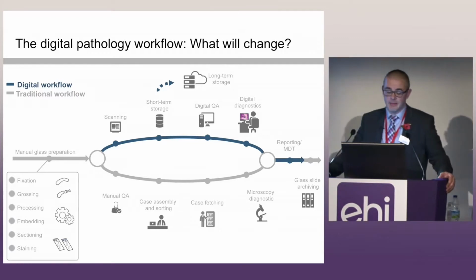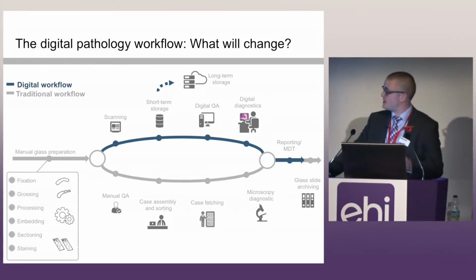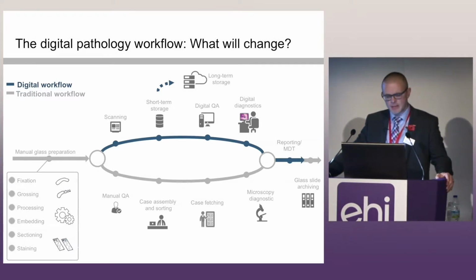That process will remain. If we follow the traditional workflow along the bottom of the slide, you'll see a huge amount of manual process involved at this point. A human being needs to check that those slides are appropriately acquired and embedded. Those cases then need to be sorted and assembled into packets. They are then literally put into a filing cabinet of sorts, where they are retrieved and taken to the pathologist for reporting and diagnosis at his or her microscope.